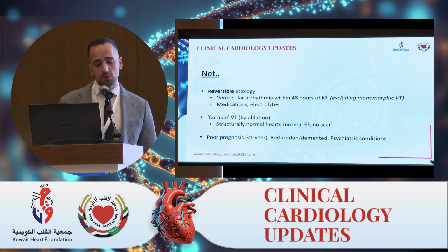And these patients usually can be treated by ablation or medications and aren't technically ICD-treated ventricular arrhythmias. And then finally, since these devices offer purely a mortality benefit and not a morbidity benefit, it is important to assess your patient prior to implantation and whether they will benefit from this. Bedridden patients or patients with metastatic cancer probably don't qualify for these devices since they will likely die from other etiologies in the near future.